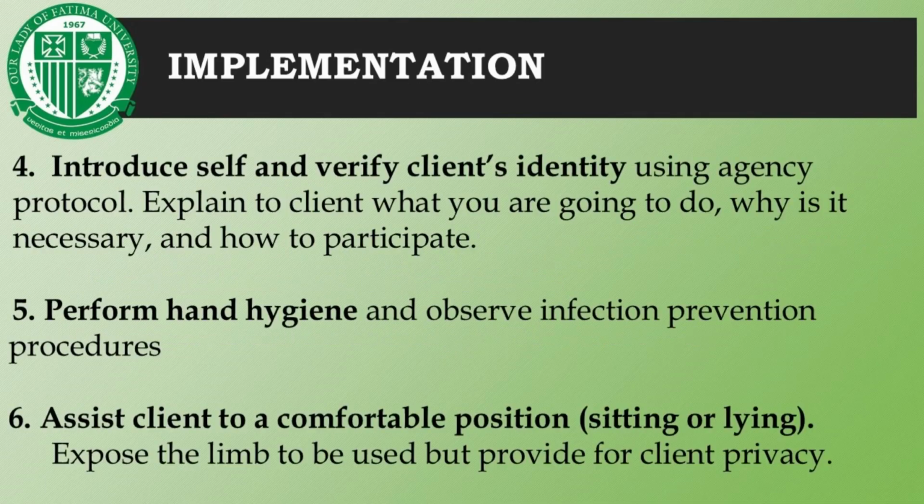For effective communication and patient cooperation, the nurse should introduce themselves and verify the client's identity using agency protocol to ensure that the correct patient receives the intended care, reducing the risk of medical errors. Explaining the procedure and its purpose helps reduce the client's anxiety, ensures informed consent, and encourages active participation in the process. After that, the nurse should perform hand hygiene.